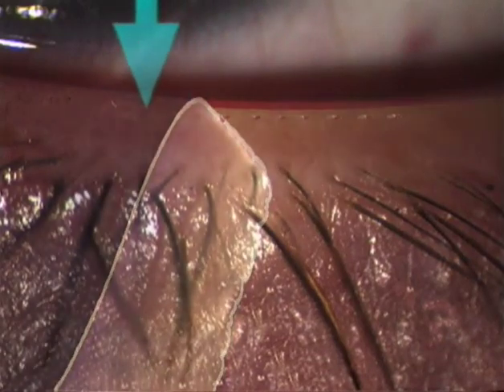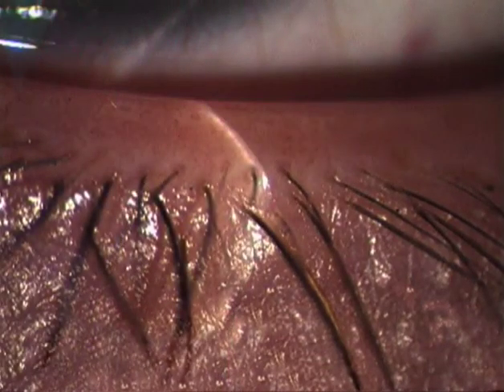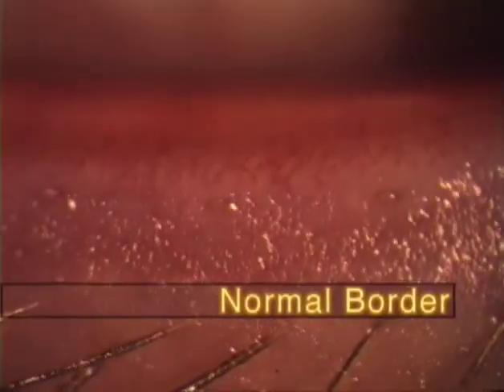In a normal lid, this border is just behind the orifices of the tarsal glands. Between mucocutaneous border and inner edge, a rim of wet conjunctival epithelium remains, as shown by the strip of wet reflection.